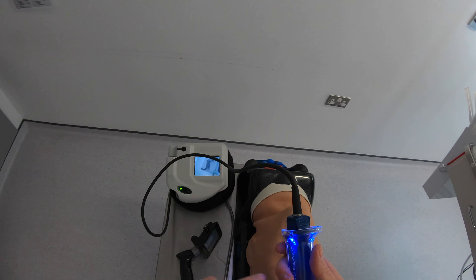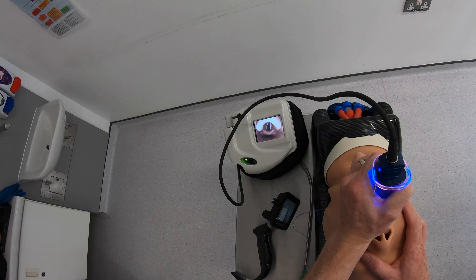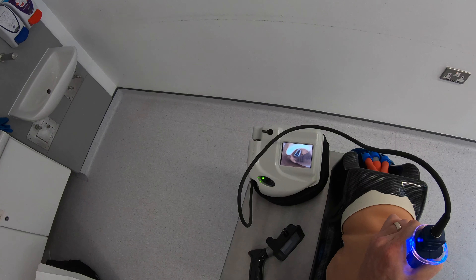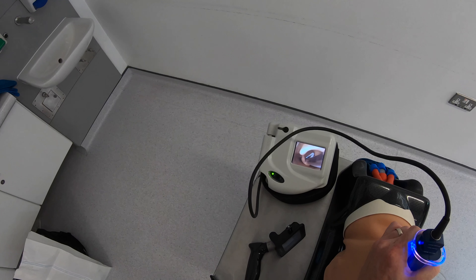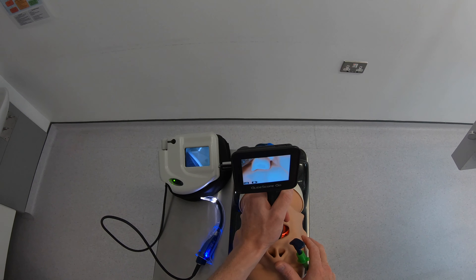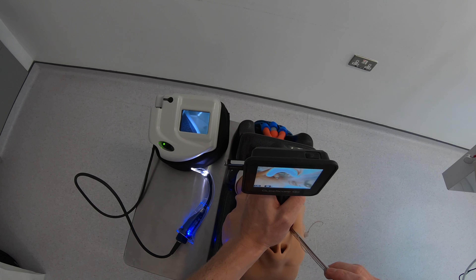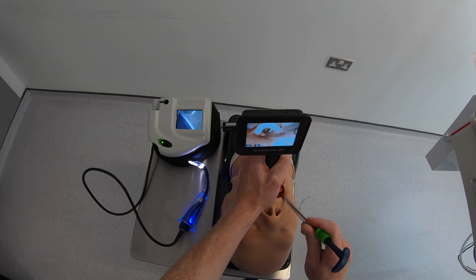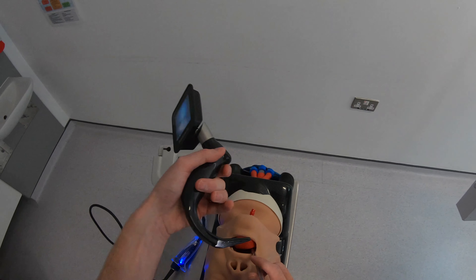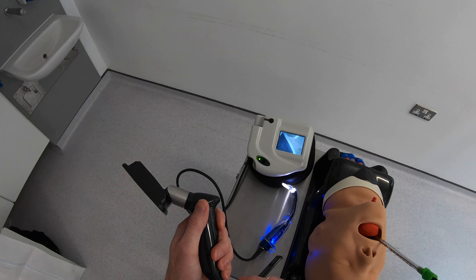What about image quality? With the older AVL system, I find the adult video baton gave much better image quality than the paediatric one, so the image quality is actually pretty good with this AVL system — the cords are nicely defined and everything's pretty sharp. If we pass the tube you can see the numbers coming in, they're actually pretty sharp too. Comparing that to the Go — the numbers are pretty easy to read on the tube. So the image quality improvement with the new spectrum blades isn't quite as great with the adult blades; your advantage there is very definitely how much thinner they are compared to the older AVL ones.